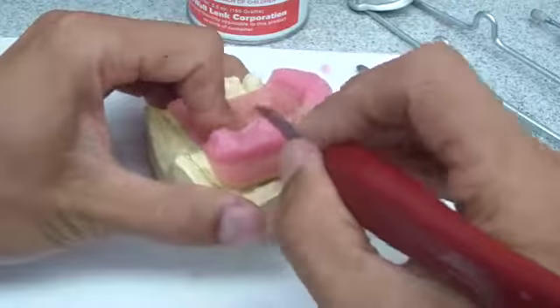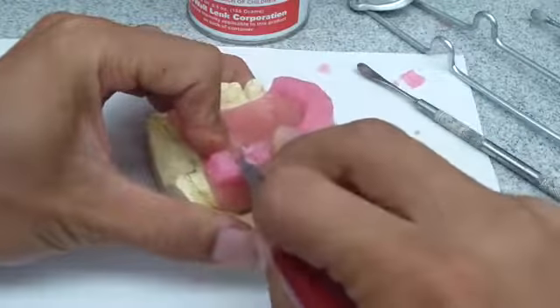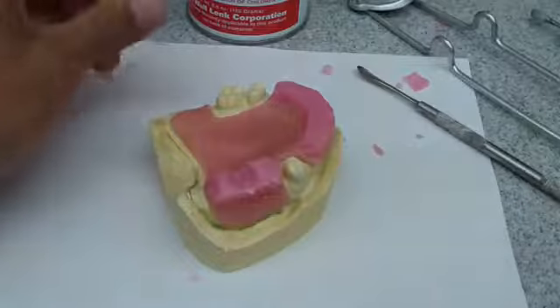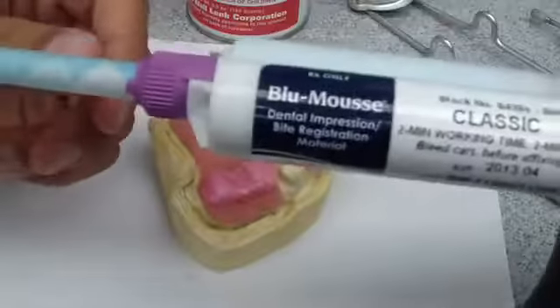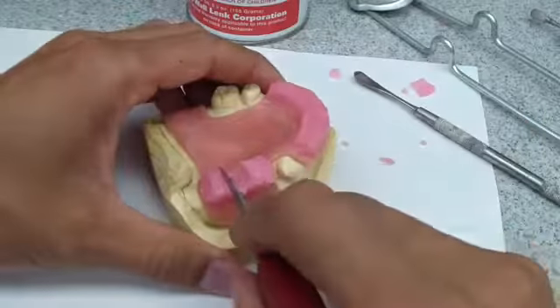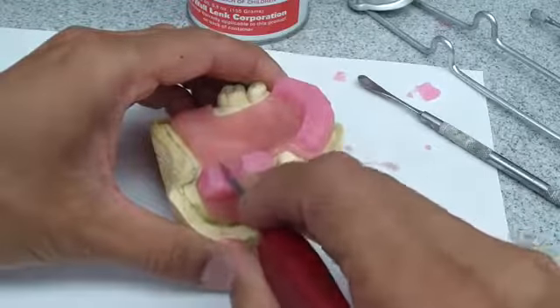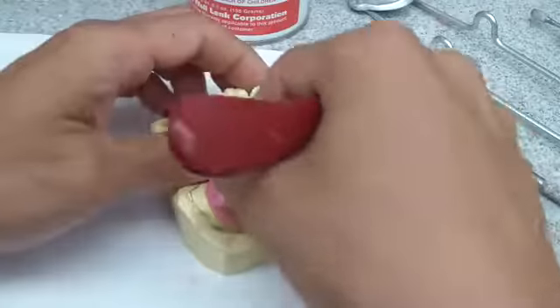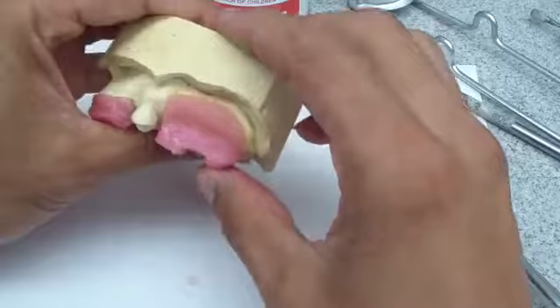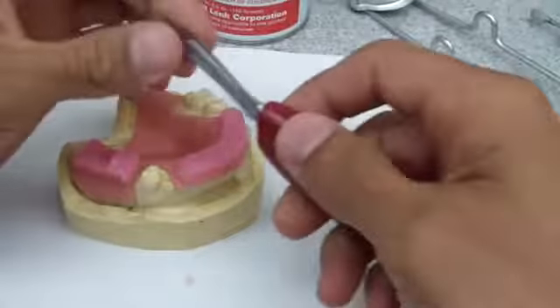make little slots similar to a complete denture, and then use a polyvinyl siloxane or Blue Mousse material. That's what we use here. I'm sure there are many different products you can use. And then make an undercut in here. Place material onto the rim, and then get the patient to close into CR. And then we'll have our record captured, and then we'll check to see if we can reproduce that.